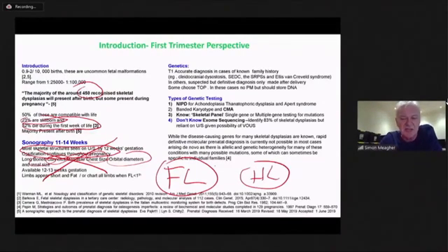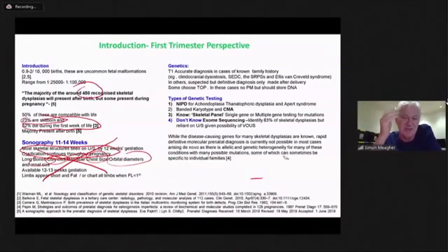And when you look at taking a femur length tomorrow morning, if you go to work at, say, 12, or let's say 13 weeks of gestation, your femur should be pretty close to a centimeter. So if you're getting a femur of around 5 millimeters, 4 millimeters, 3 millimeters, you're looking at a skeletal dysplasia. But if you're experienced in the first trimester, it's not actually the measurement that catches your eye first. It's those plump limbs we talk about, and they look plump because the bone looks short in comparison to the size of the soft tissue of the limb. And that's how they catch us, and I'll show you examples of that in a second.